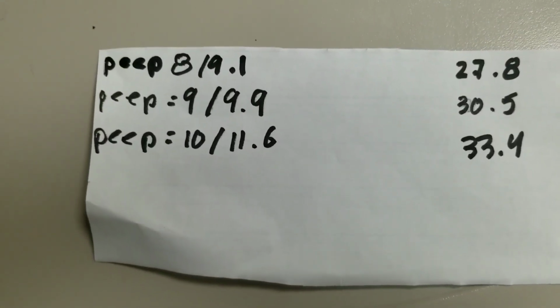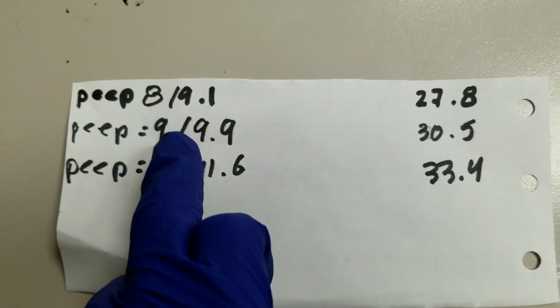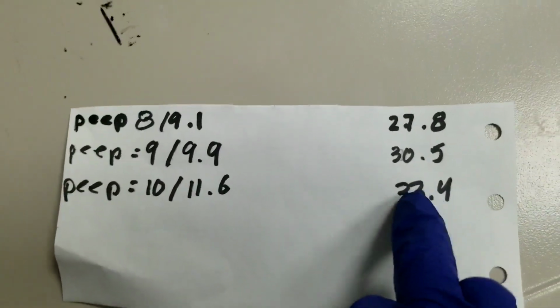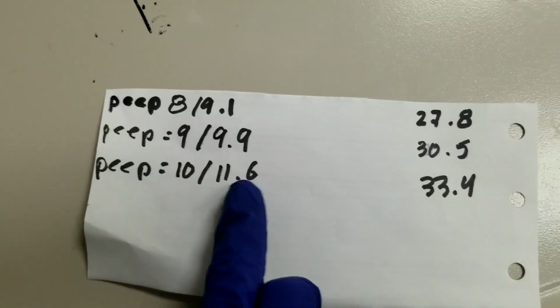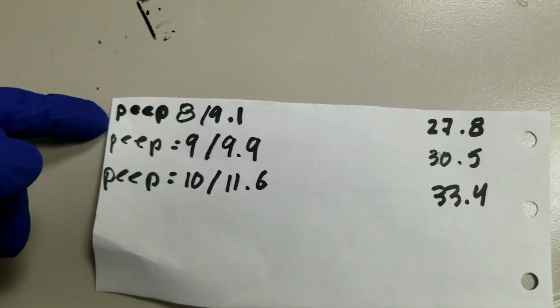All right, so this was the previous one I did, so that was actually the second time that I did it. So we see that we went from 8, then 9, there was a significant jump, and then there was an even more significant jump. These are the plateaus, guys. These are the PEEPs, and these are the intrinsic, the total PEEP basically. So it seems like a PEEP of 8 is the ideal PEEP.